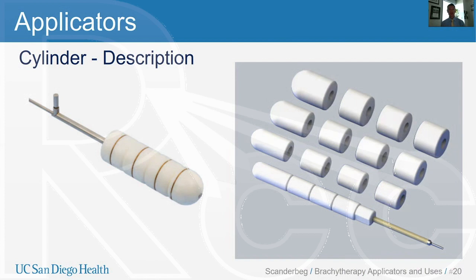So typical segment diameters or applicator diameters range from about 2 cm to 3.5 cm in 5 millimeter or 0.5 cm increments.